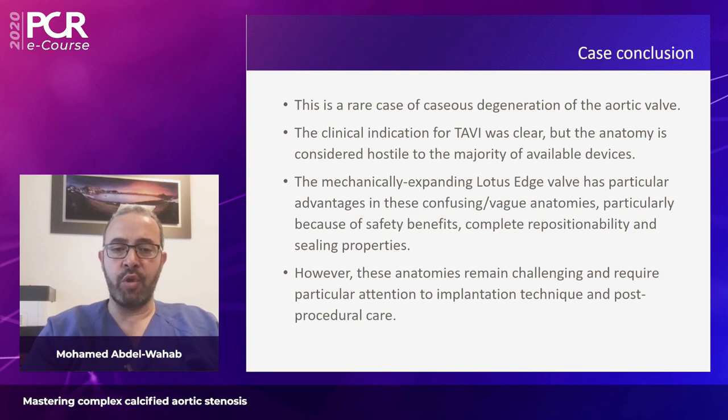However, we need to know that these anatomies remain challenging. They require particular attention to the implantation technique and also to post-procedure care. And by this, I give the word back to Lars, and I think we can discuss the case briefly. Thank you.